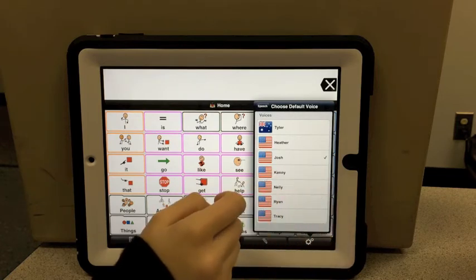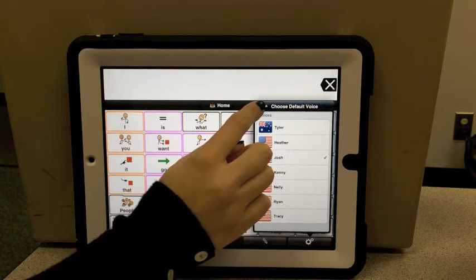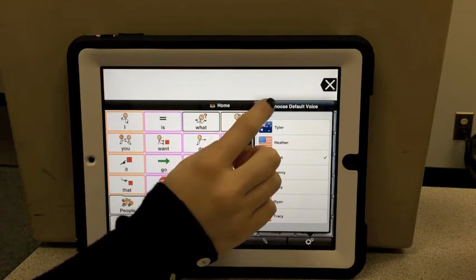Hello, my name is Josh. I am one of the Child American English speech synthesis voices from the Acapella Group Assistiveware Premium Voices collection.